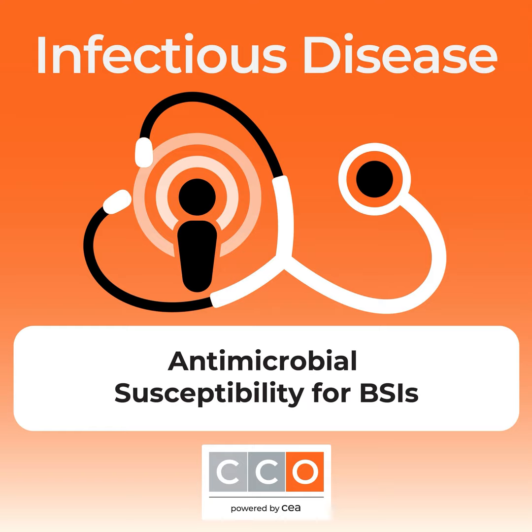So we have multiple rapid diagnostic PCR tests in clinical use currently. I always say that it depends on the situation and the condition that you have. We have the BioFire FilmArray, with 33 different organisms and detection of resistance genes, at around a 1-hour turnaround time. We have the Cepheid, specifically for gram-positive cocci in clusters, to define MRSA versus MSSA. We have the ePlex, which used to be GenMark and is now Roche ePlex. They also cover organisms beyond pathogens that can be identified as contaminants. They can help with escalation.